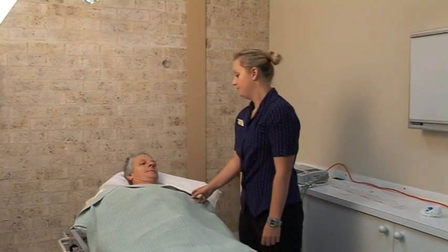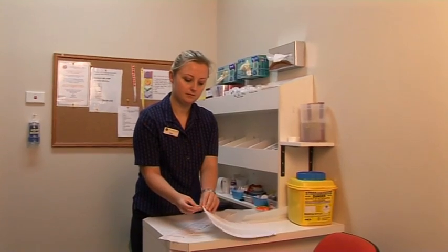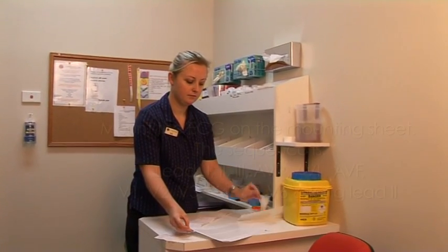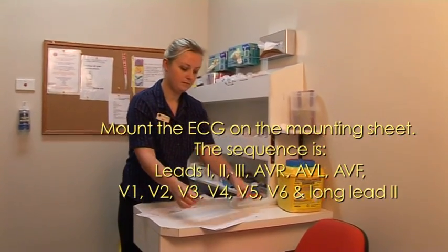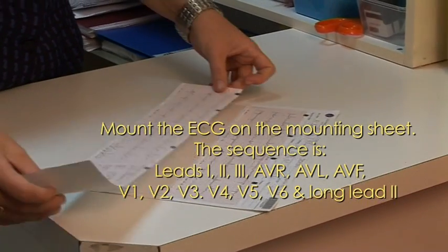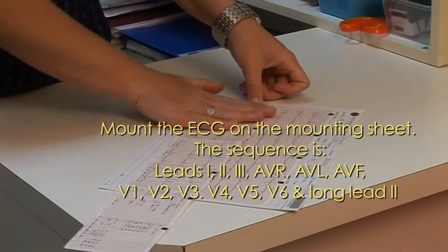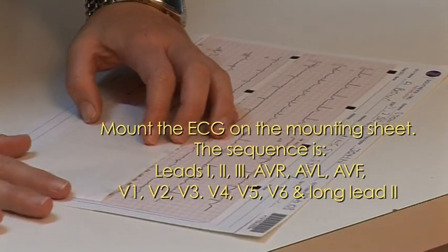Thank you. The ECG is mounted in the following sequence: leads 1, 2 and 3, AVR, AVL, AVF, V1, V2, V3, then V4, V5, V6 and the long lead 2.